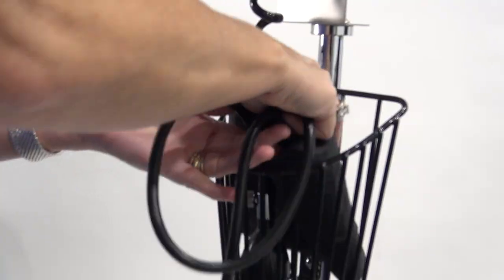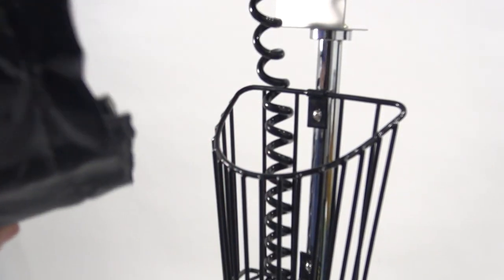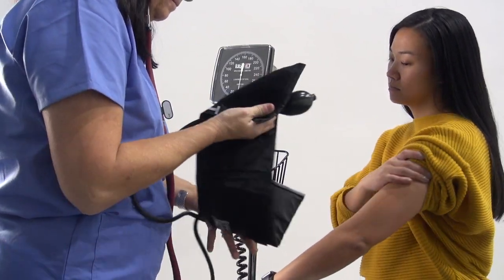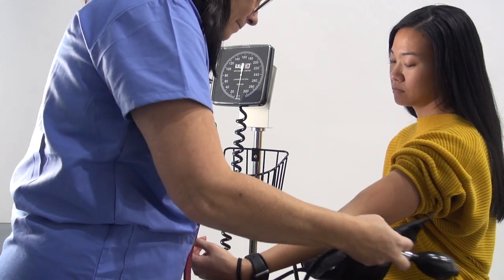The storage basket is included, providing a storage space for the AccuMax nylon cuff and 8 foot coiled tubing.